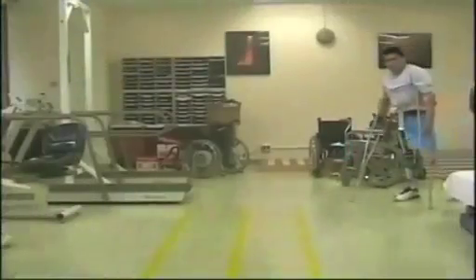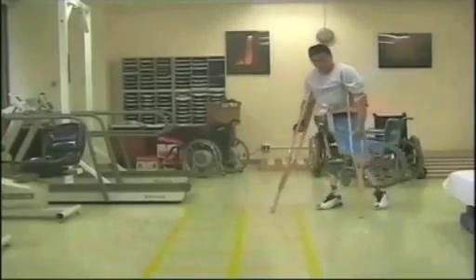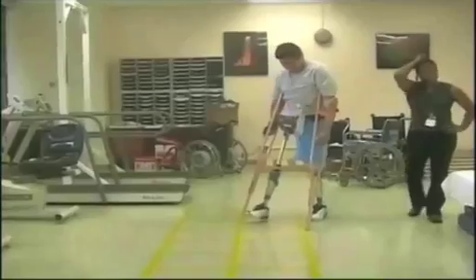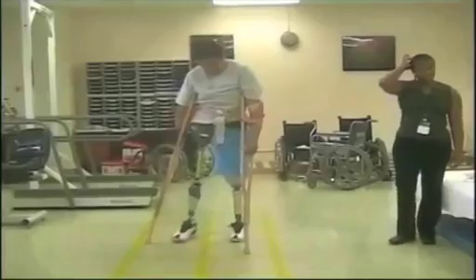As a testimony to current prosthetic technology, he is out of the wheelchair. But as you can see, he still requires $100 crutches to walk, even though he's on $100,000 worth of prosthesis.